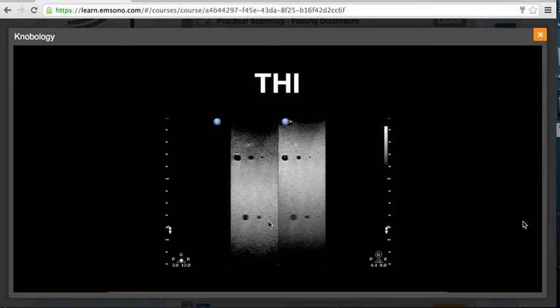So you'll see on a lot of the images throughout these modules that tissue harmonics is used, and I think that it does help with a lot of image quality. But this is something that you may have to play with on each individual scan. There may be times where you put harmonics on, don't like how it makes the image appear, then it's fine to just go back to the non-harmonics images.